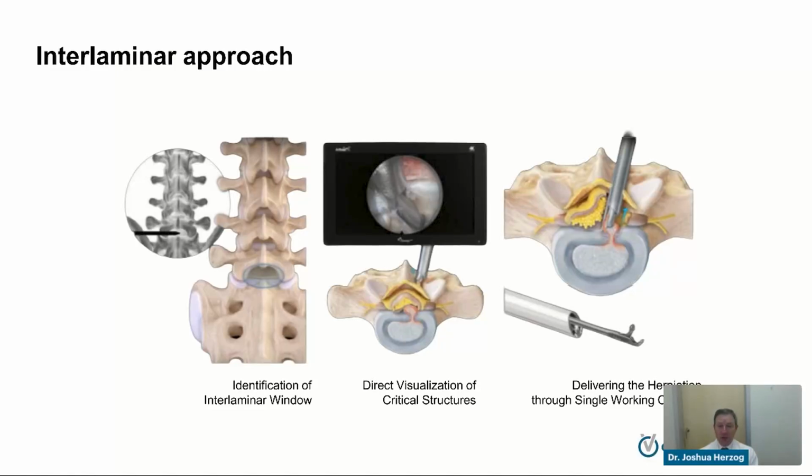But now we can put a small endoscope down there and find the disc, and then take that disc out that's pushing on the nerve and remove it. So that's what we're showing. That's the sequence and the steps. So from the left, that's the window.